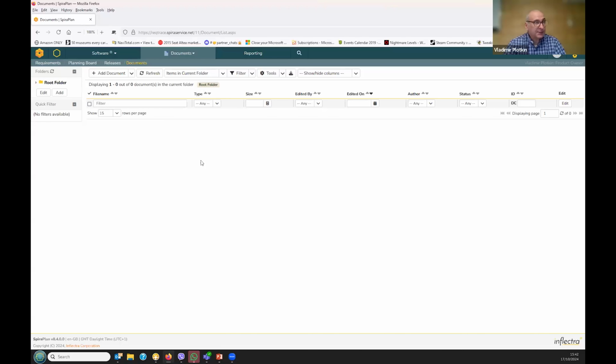Same thing when you're developing software, you need to know that your tools are actually staying the same, unless there is some really, really good reason to upgrade. So, for example, compilers: you start with one compiler and you validate it for use and you use it for the entire project, unless you find a really big bug which is stopping you from progressing. And that's the reason why you're going to upgrade.